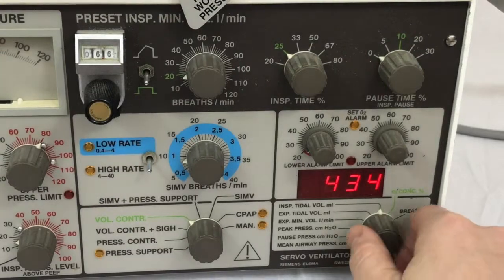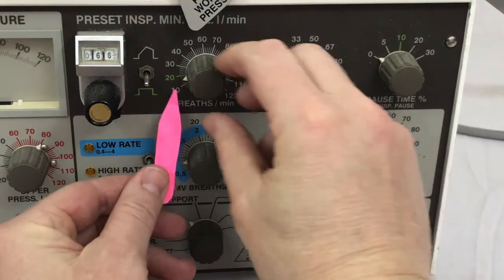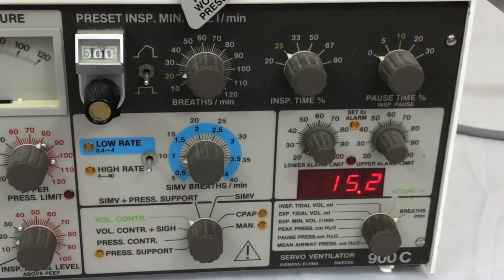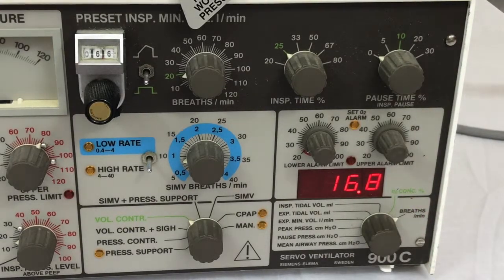With the Servo 900, I do not have a tidal volume setting, so what I'm going to have to do is manipulate my respiratory rate. I'm going to turn this up to approximately 17 to get my 400 milliliter target for my tidal volume. And as you can see, there's my measured rate at 16.8, almost 17.